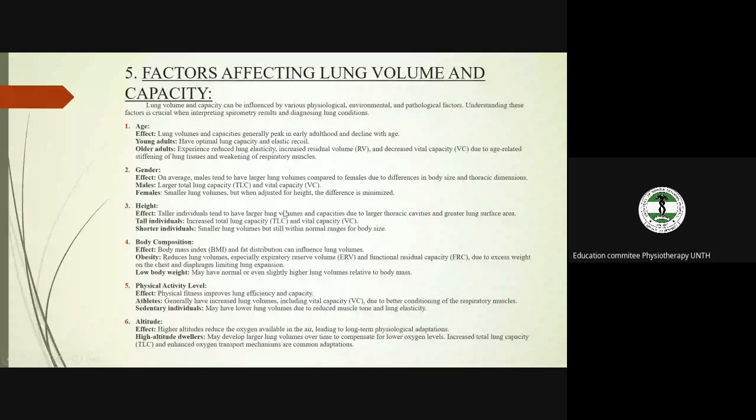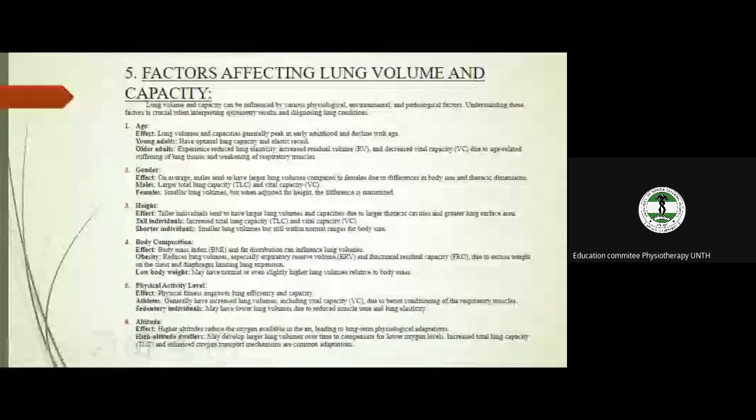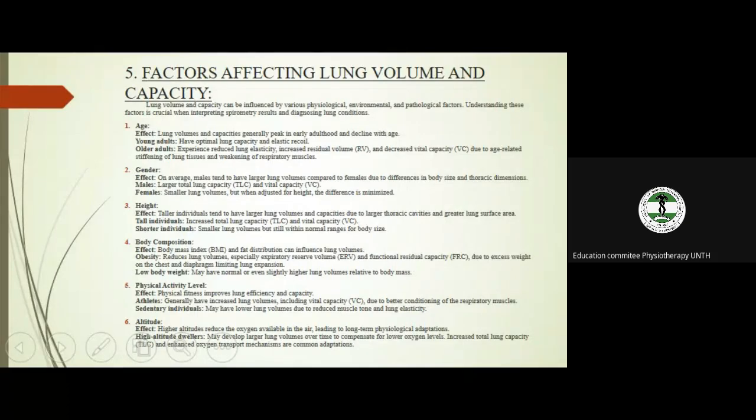The day I tried the spirometry, I was like, so this is what these kids do. It's very difficult for me. When you see the kids blowing out the air in their lungs, it looks very easy, but it's not easy in older adults. So age is one of the factors that affect lung volume and capacity in spirometry.